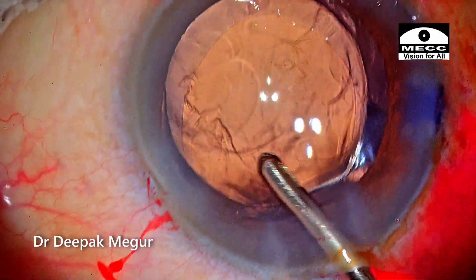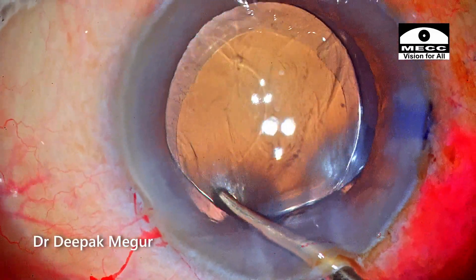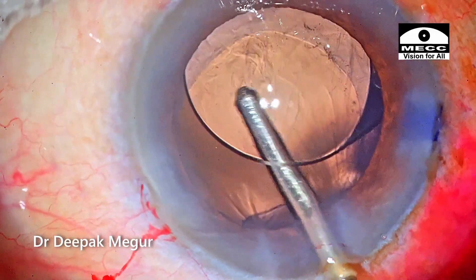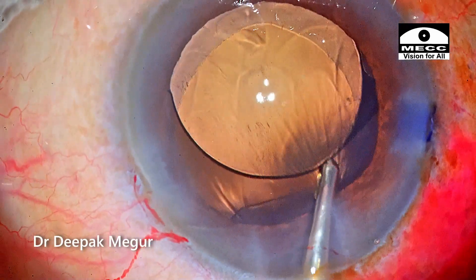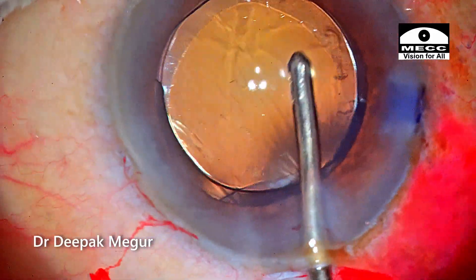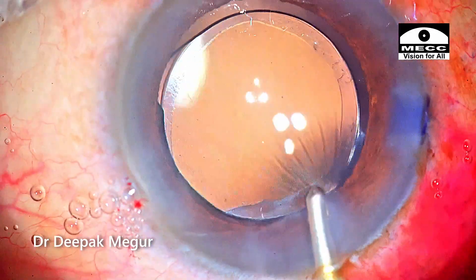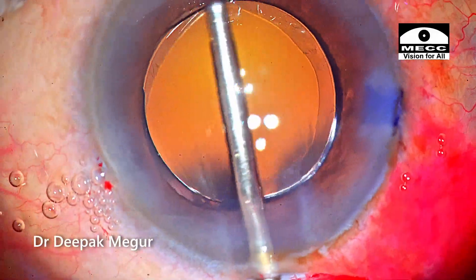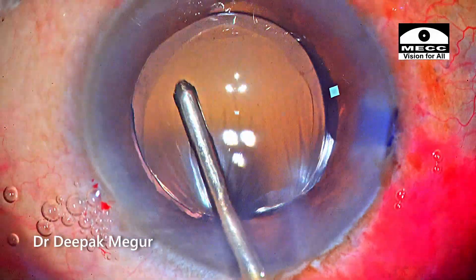Removing the OVD in such a situation is again tricky. As I introduce the irrigation cannula under the lens, I need to be conscious not to cause any sudden deepening or shallowing of the chamber, because any change in chamber dynamics can extend the tear to the posterior capsule. Finally, the OVD behind and in front of the lens is removed.